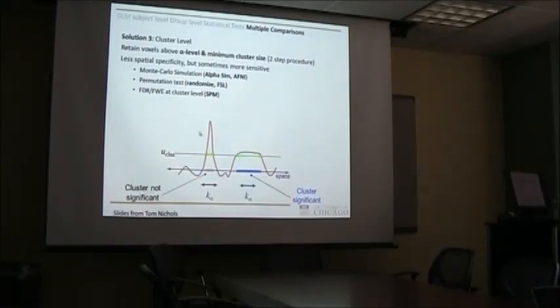And it's always a little bit tricky. There's a lot of literature on this, on how to choose the combination of your initial threshold level and then how to determine what the spatial extent of your cluster should be. I think we could put some papers on this topic on our website.